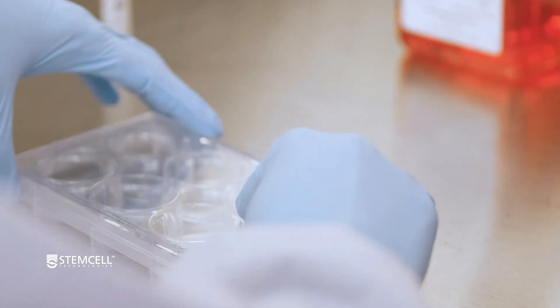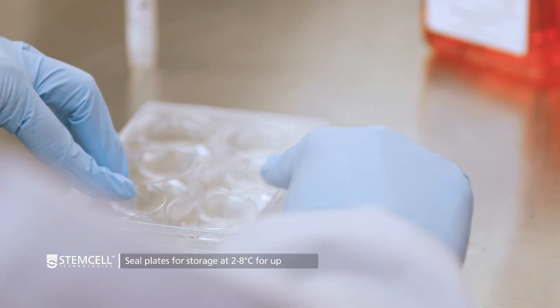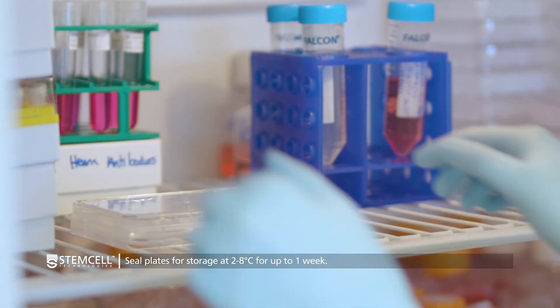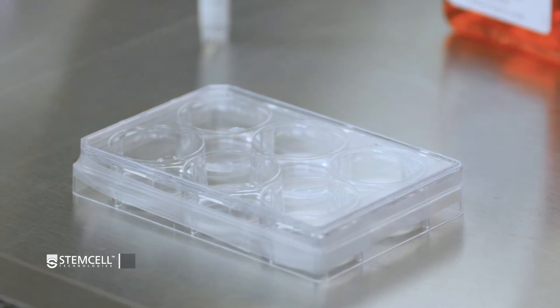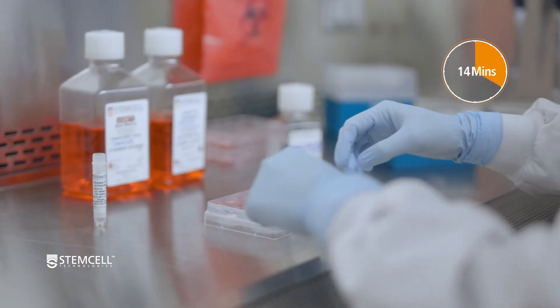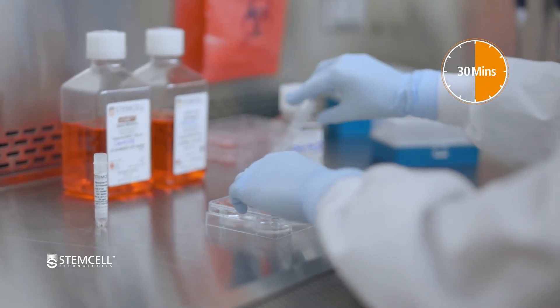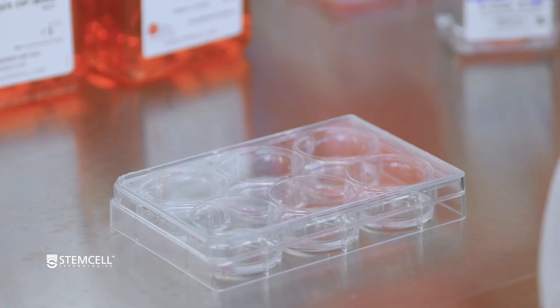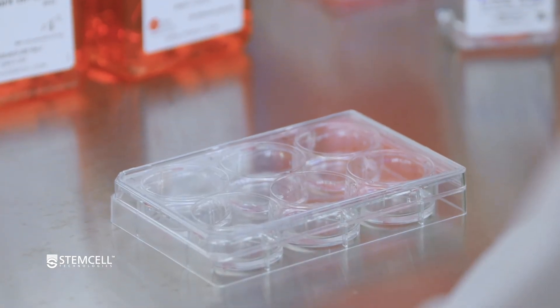If the coated plates are not needed immediately, they can be sealed using parafilm and stored for up to 1 week at 2–8 degrees Celsius. When the stored plates are required, allow them to come to room temperature for 30 minutes prior to proceeding and ensure that the Vitronectin XF has not evaporated. If Vitronectin XF has evaporated, do not use the affected wells.